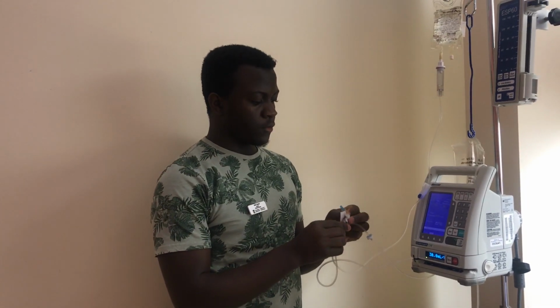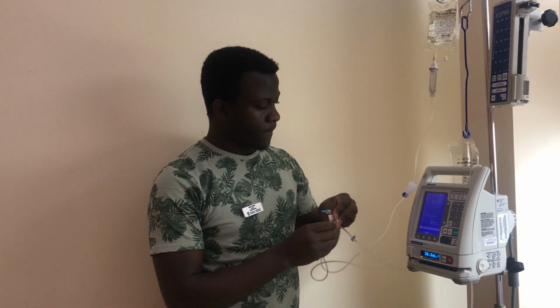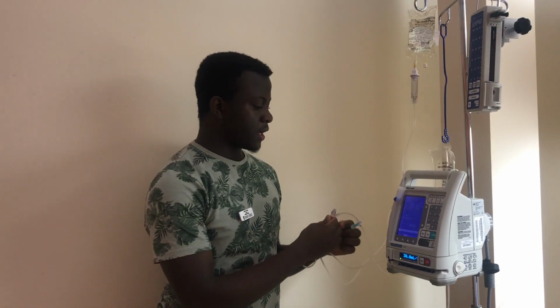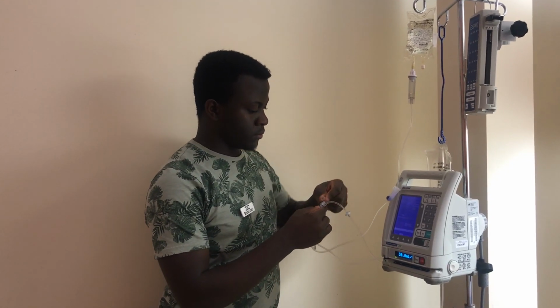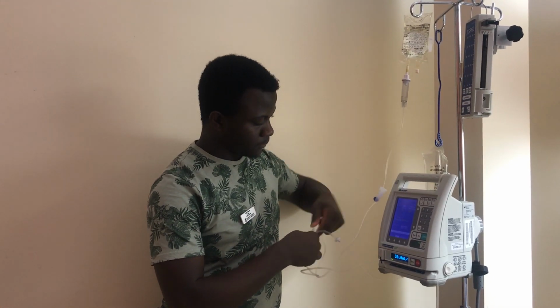I'll also put the swab into the sharps container. Give it a good 30 seconds. And now I'm going to use a sterile cap. Let it dry for 15. And once this is clean, I cannot touch it again. I have to maintain sterility here to connect my port. Like this. And I'm ready to go to the bedside. So I'm just going to put my label on this.